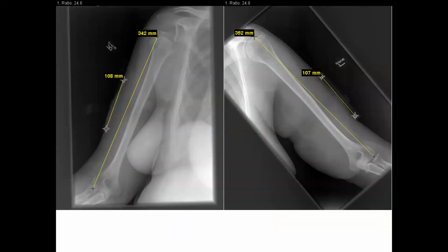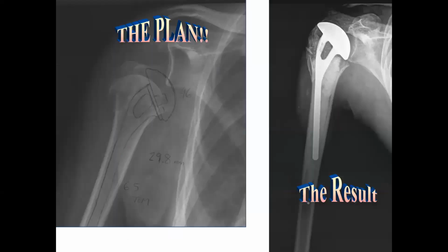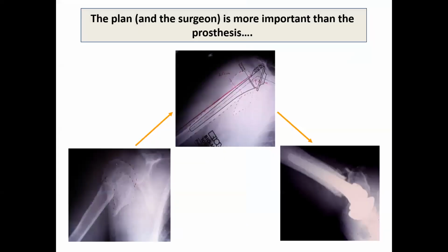So this is an X-ray, as you can see on the right side, this is the normal limb with no fractures. And we draw a line from the upper head till the elbow, as you can see. And on the contralateral side, I mean the fracture side, we draw a line from the fracture to the elbow. And now we have an idea of where exactly we should put the stem, at which height, I mean. So if you have a very good preoperative plan, the result, as you can see on the right side, will be good, and the patient will be happy after that.